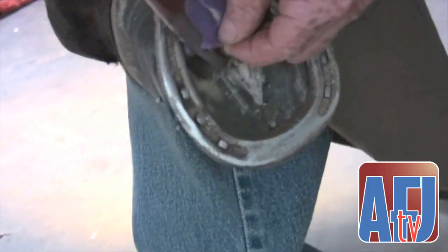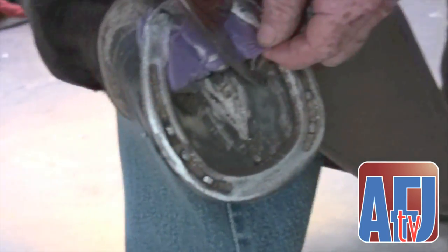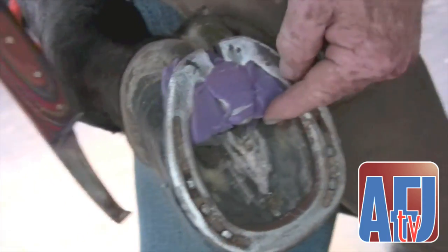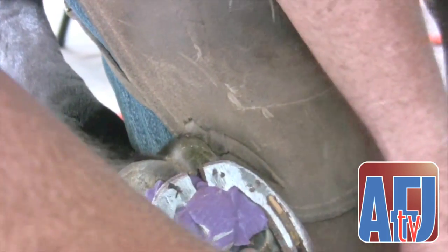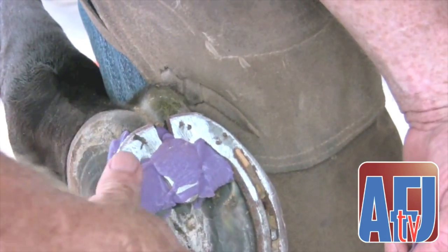Sometimes you have to experiment to see which material is going to work best. In my opinion, with this shoe application, the Vet Tech silicone packing does the best for me.